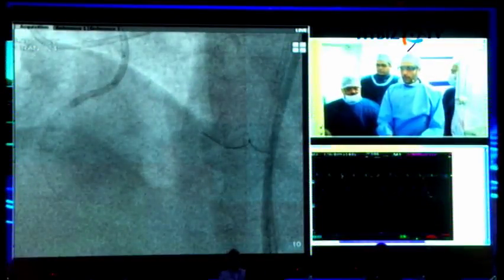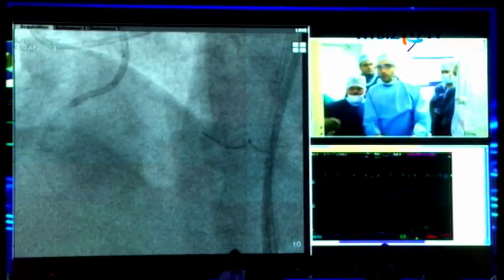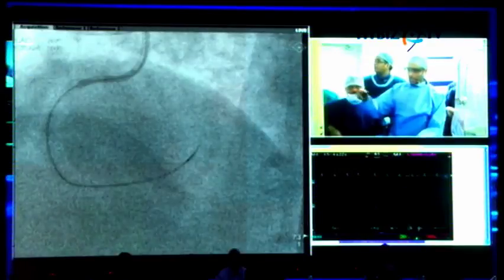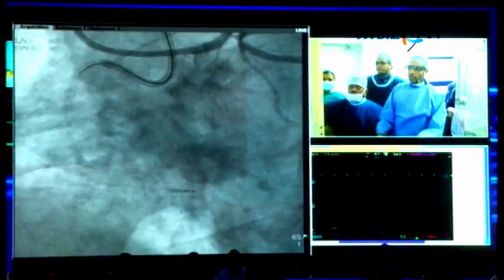That is a Sion 3, right? Which wire do you want? Sion wire first. Arun, we are with you. Sion, sorry, Sion. Back. Okay, back. Okay, good. All right, good.